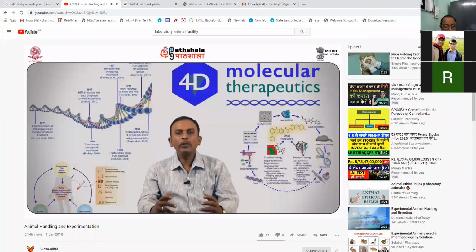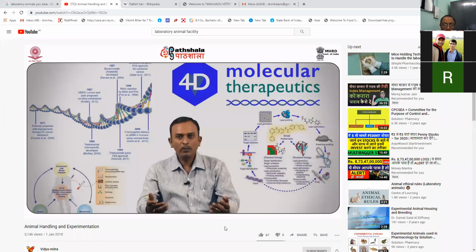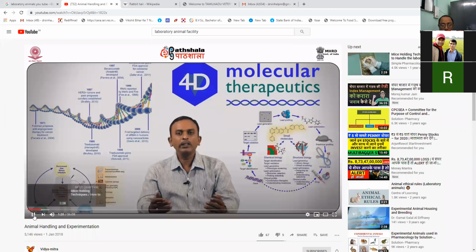Why do we need mouse? We do not need birds, rats, or other animals like elephants and tigers. Mice are mammals. People are also mammals, and many human diseases can be authentically modeled in mouse. What do you call it, changing the gene, or how we create knockouts and transgenics, where we insert the gene, and this is how we.